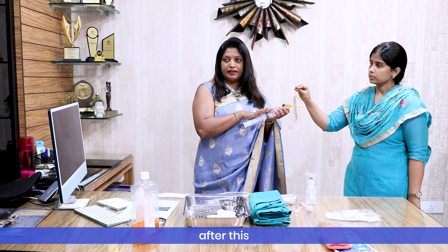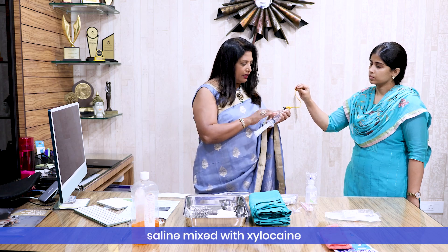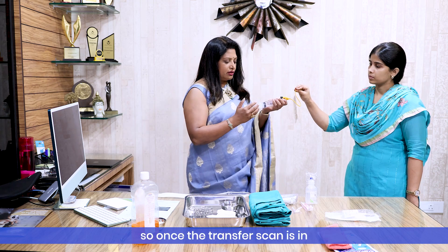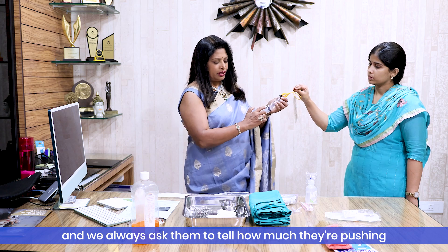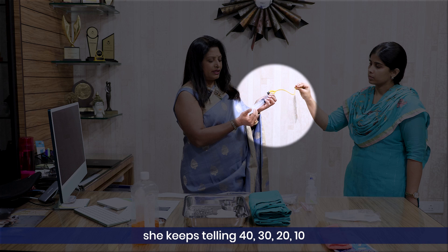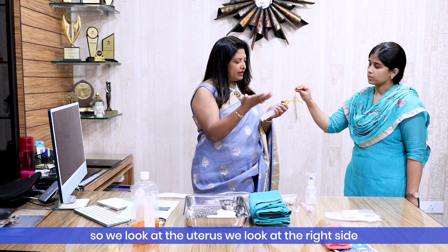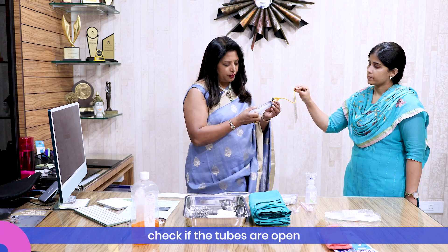After this, the nurse will push the saline mixed with xylocaine while we do the transvaginal scan and watch on the screen. The nurse keeps telling us how much she is pushing — 50, 40, 30, 20, 10 — so we know how much fluid has been pushed. We capture images on the screen, looking at the uterus, the right side, and the left side, to check if the tubes are open.